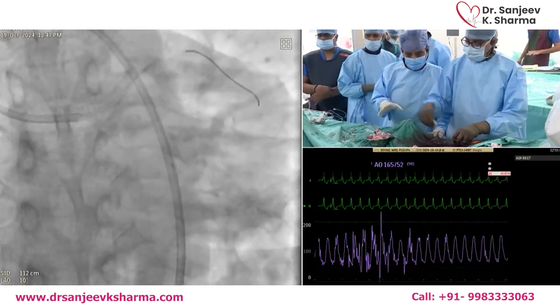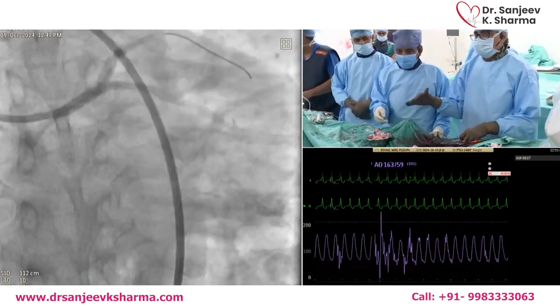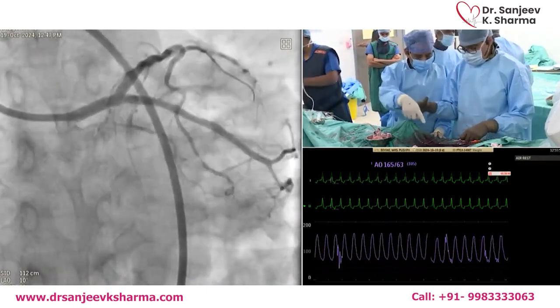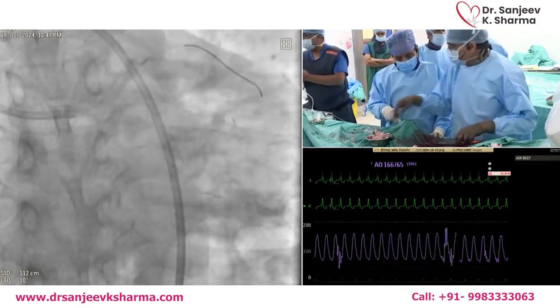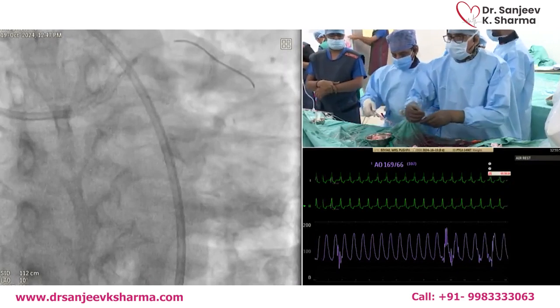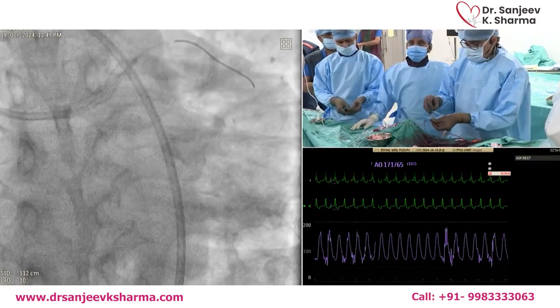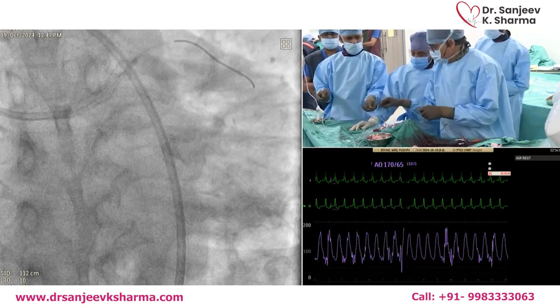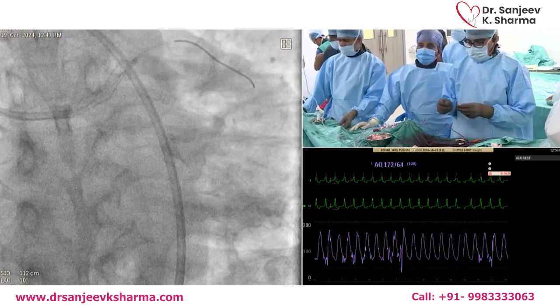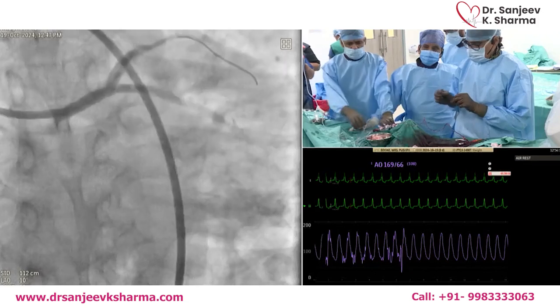We always do the kiss and then POT, because otherwise it's POT, re-POT, all those things they talk about. And even with the non-left main, they do cross now. You have the wire. No, hold on one second. Before you go to POT and re-POT, you can see that the distal circumflex needs a little optimization there. So the high pressure balloon needs to go first distally, optimize the circumflex stent, and then do the kiss balloon, and then finish with a POT.